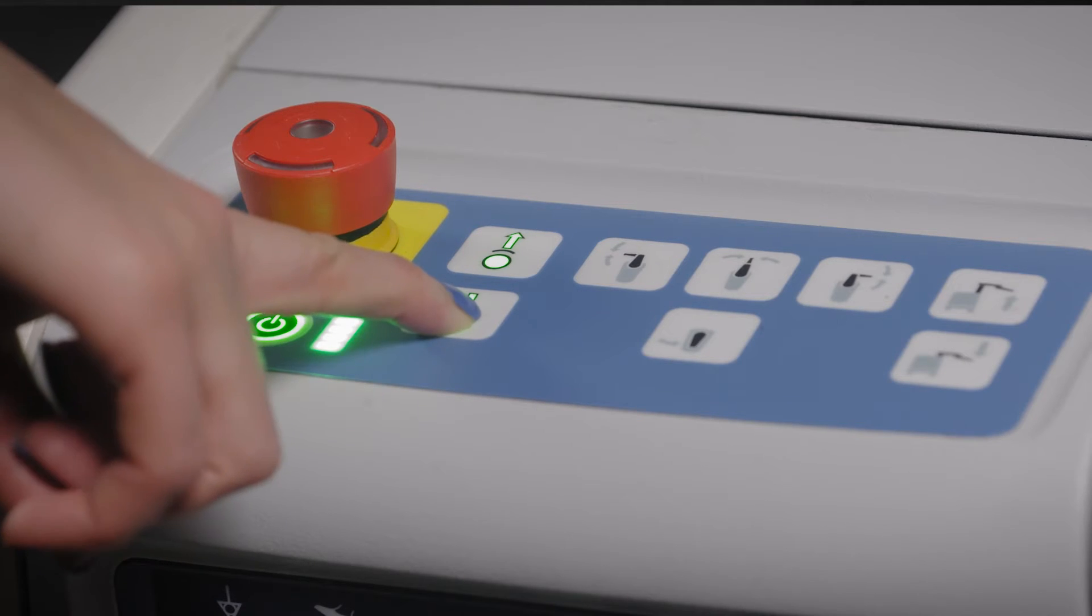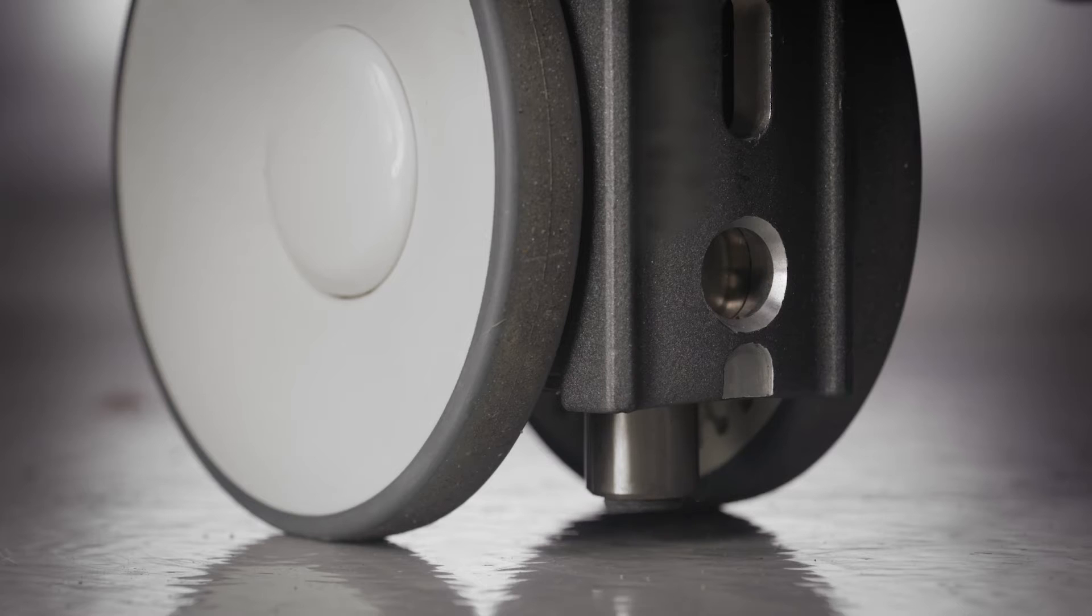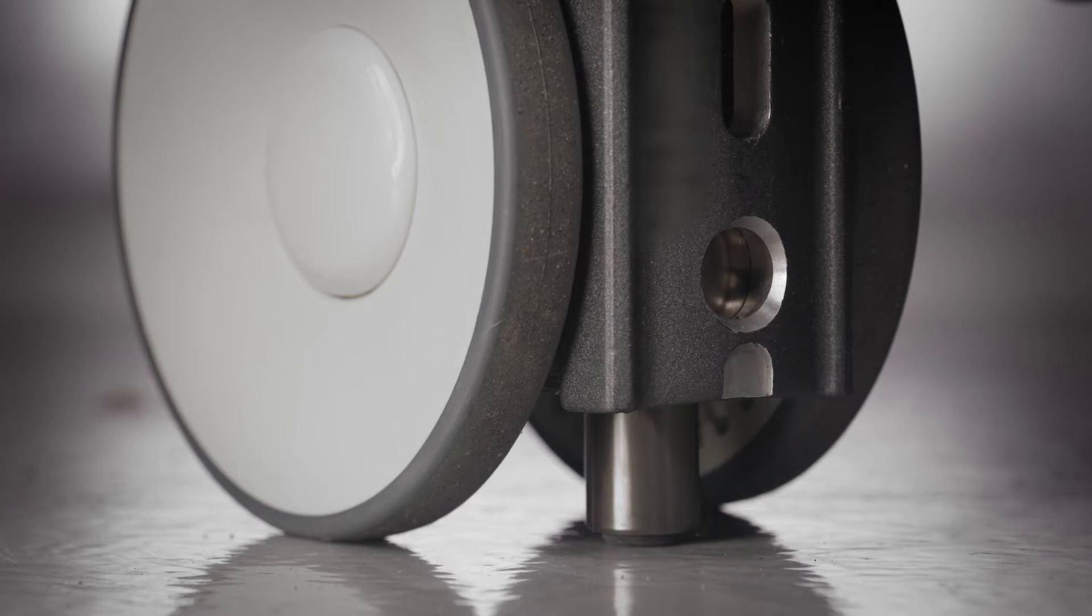This mobile platform allows you to set up the robotic base station and camera to best fit your needs throughout the entire procedure. Once the base station is in position, a simple press of a button deploys four stabilizers, which independently engage the floor and provide stability, independent from the patient and the OR table.